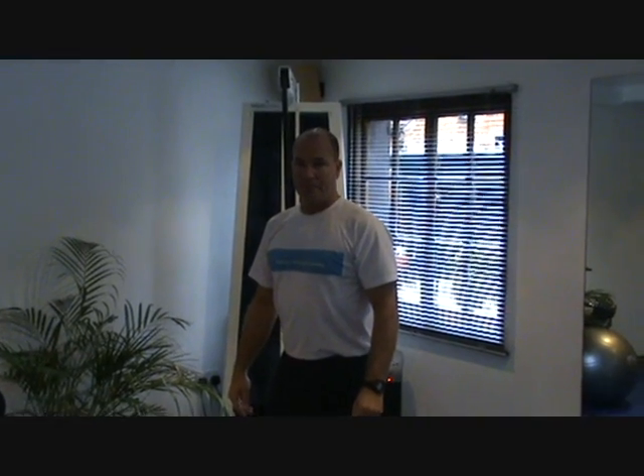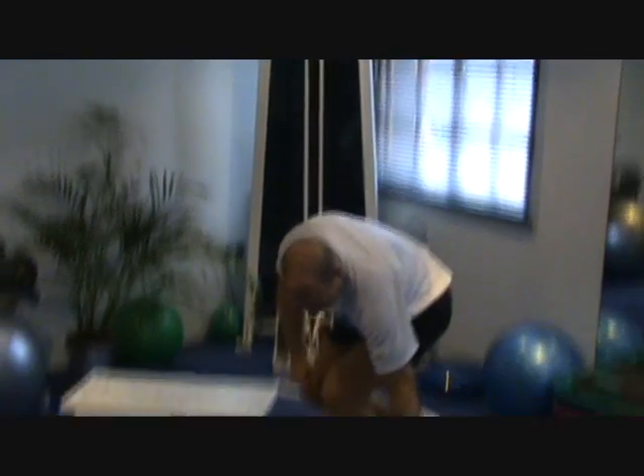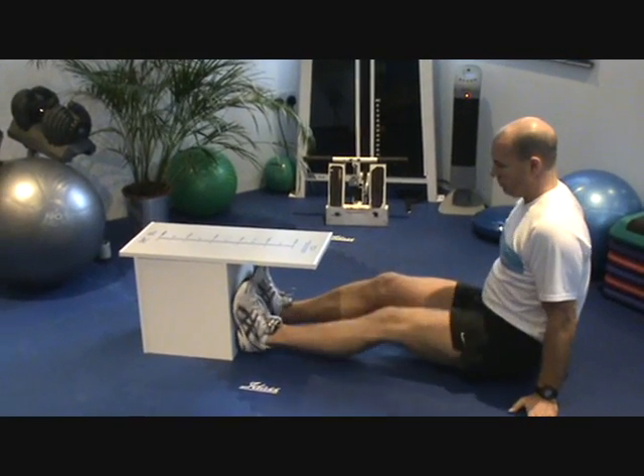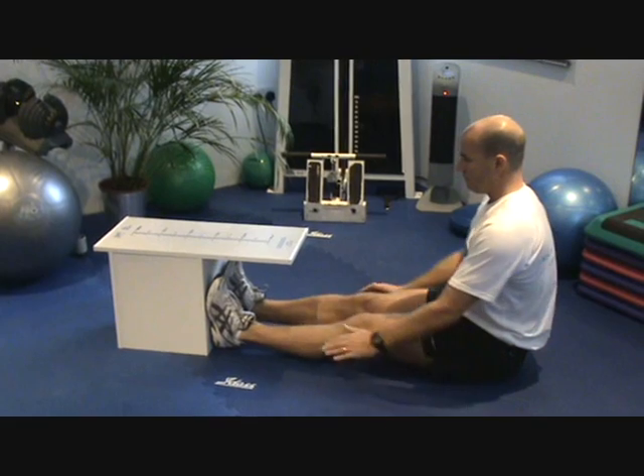To use a sit and reach box, sit on the floor in front of your sit and reach box. Put your feet flush against the base of the board. Keep your legs straight but not locked out.